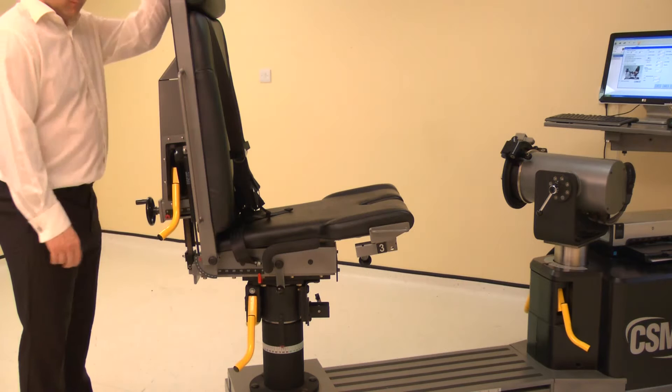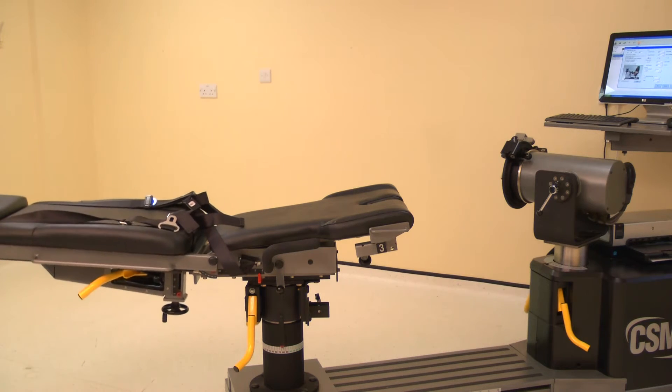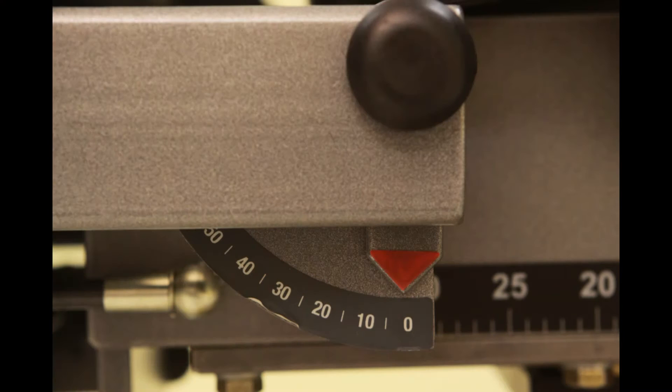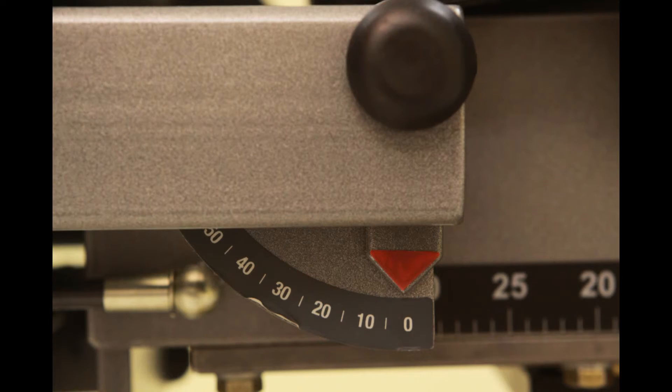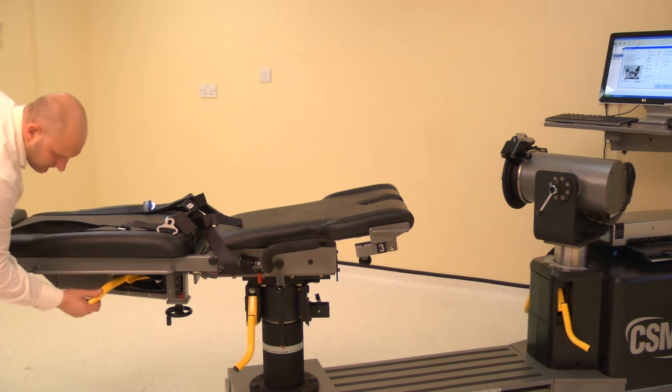To set the chair back angle, lift a locking handle and adjust the chair back. For the prone position, adjust the chair back angle to 0 degrees. Ensure both locking handles are pushed down to secure.